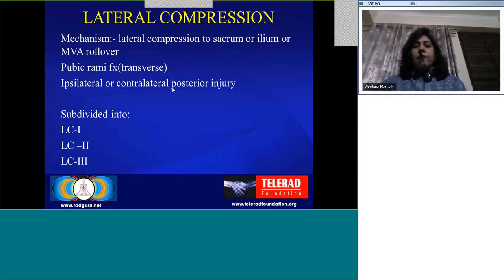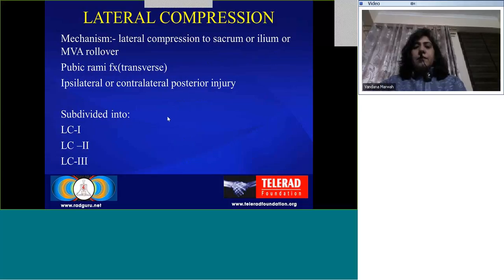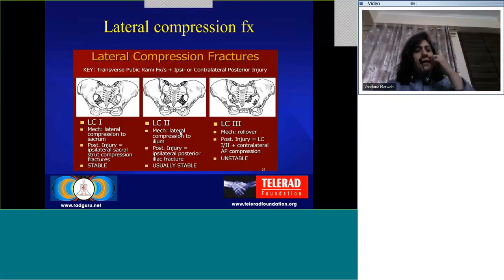Coming to the first type — lateral compression fractures. The basic mechanism is lateral compression to the pelvis, either to the sacrum or the ilium, or there may be an MVA rollover. The fractures seen are pubic rami fractures, which are generally transverse in orientation, and there may be an ipsilateral or contralateral posterior injury. These are subdivided into three categories, but in all categories there will be a pubic rami fracture and some kind of a posterior injury. As we approach them systematically, these are not very difficult to understand and classify.